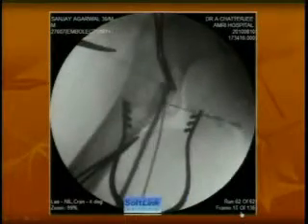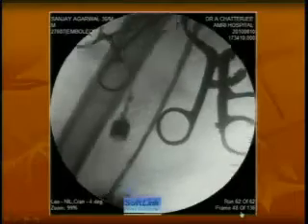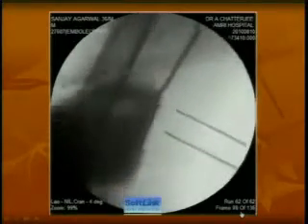Target point actually, from where we can perform a refashioned amputation. And now it is reasonable. I deliberately didn't put a stent in the SFA because post-amputation he will be walking with a prosthesis which will subject it to a significant amount of shear and stress which can cause stent problems.